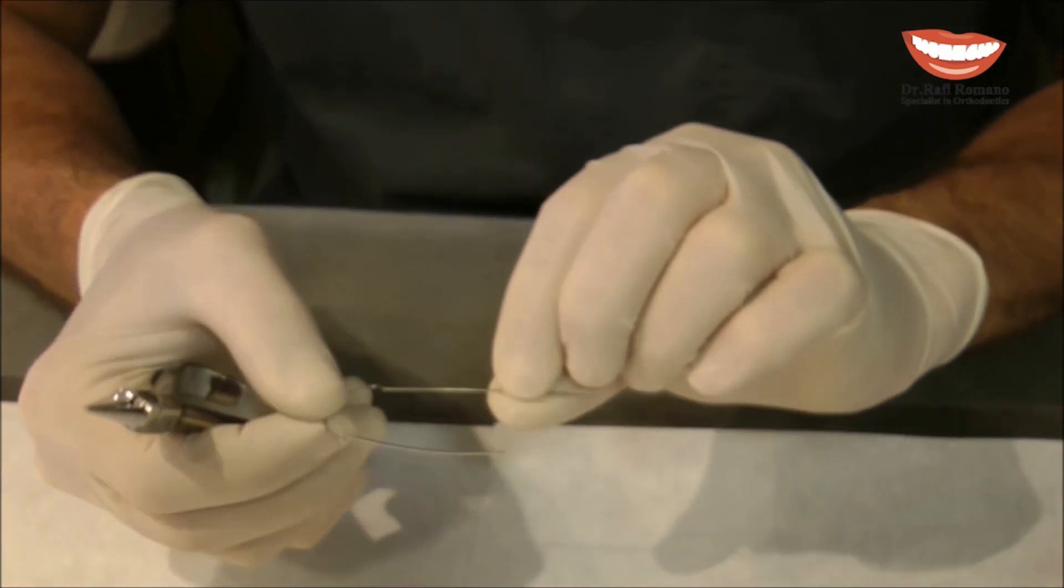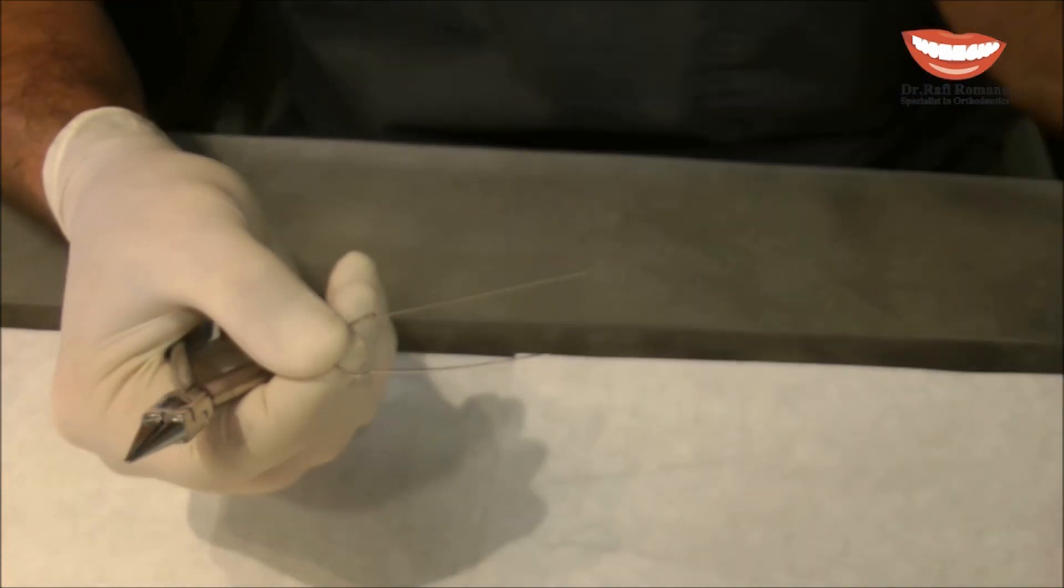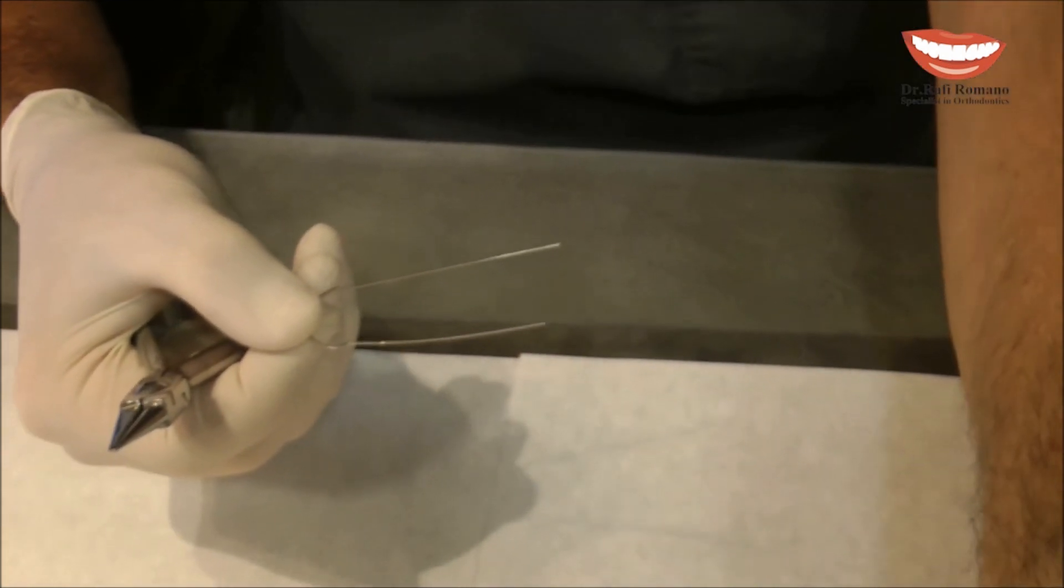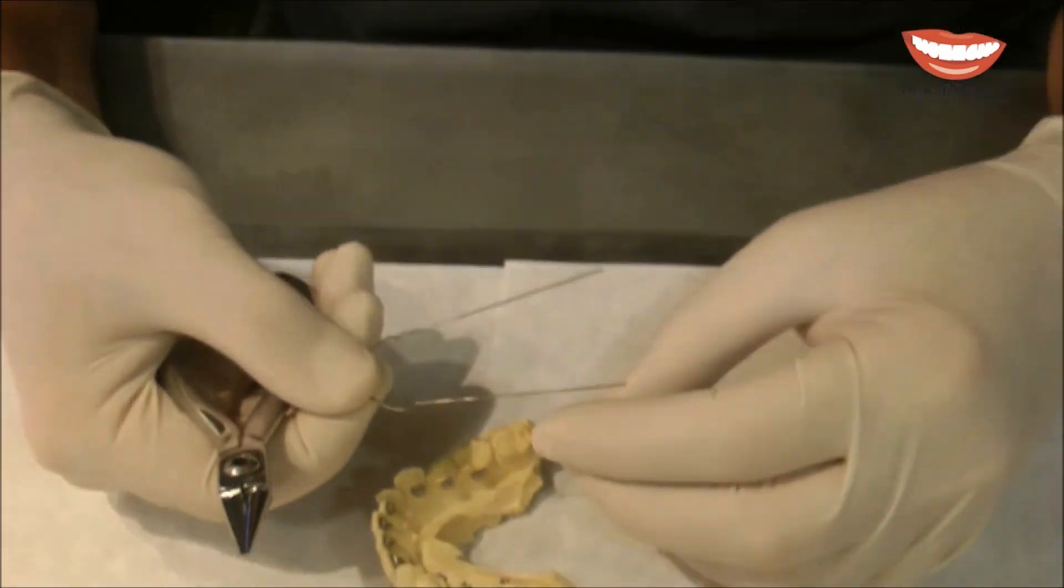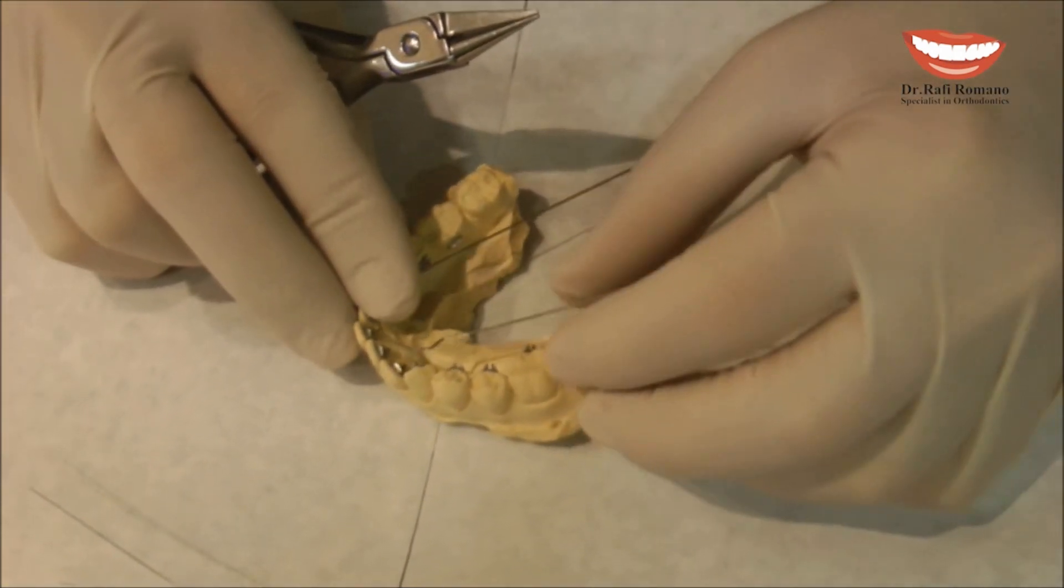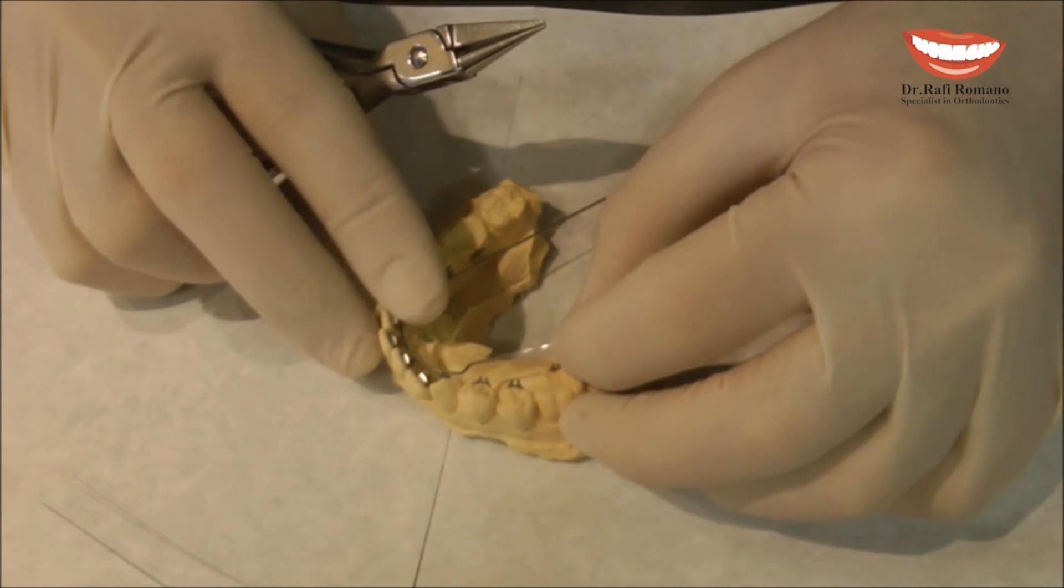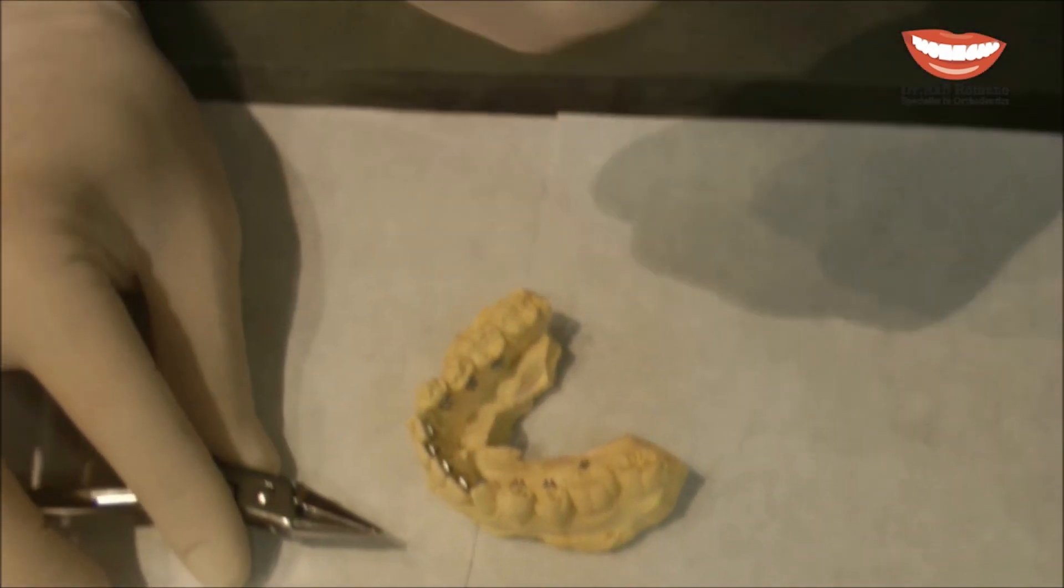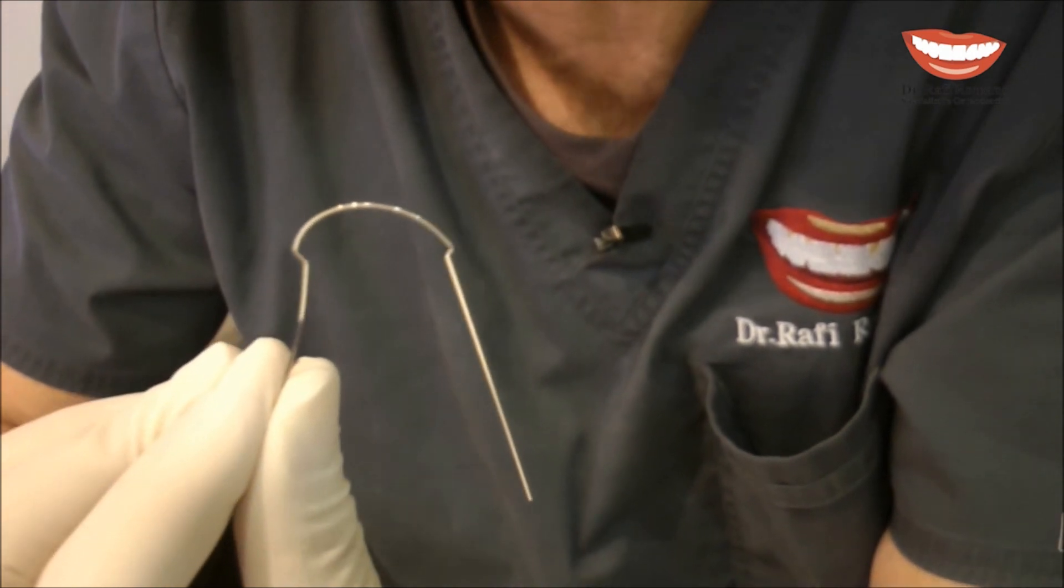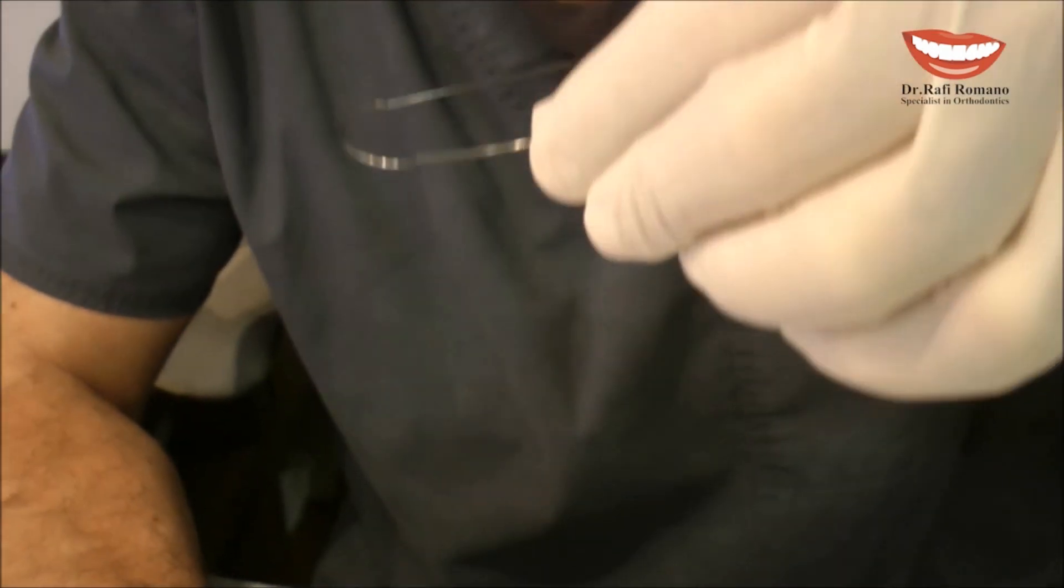Now when you want to know if the band is big enough just imagine where you cut the wire. If this is your arch the wire will be cut eventually here. So now you can see that the band that we have made is too small.